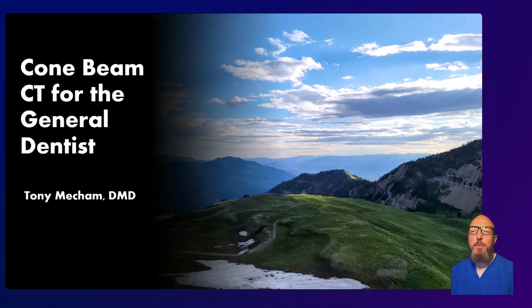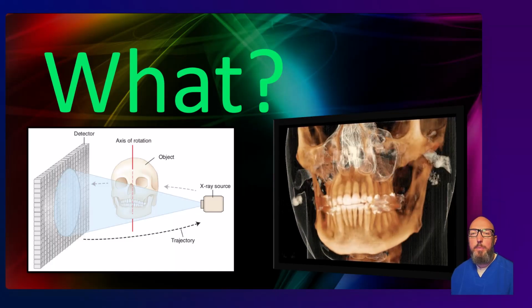So I'm not trying, and we don't have time, to make you an expert in CBCT in these 3 videos. That's a separate task. What I want you to understand is enough of CBCT to make sense of the cases that I'll show you throughout the course and to make informed clinical decisions on when to order one. All right, so what is a cone beam CT?